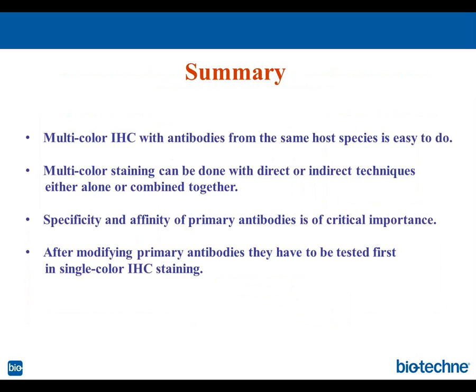The question here is about using cultured cells. Are there any tips for using the direct technique on human primary cultured cells? The same technique can be applied to human primary cultured cells. That's exactly the same way to do it. The only thing you need to find out is which fixation is going to be the best for your sample. Is it going to be formaldehyde, a cross-linking reagent which cross-links proteins, or precipitating fixatives like acetone or alcohol, which will precipitate your targets? We found that on cells sometimes the precipitating fixatives give better results. So you need to test this as well, to see which one works the best. But yes, absolutely, you can do it. You can fix your cells.